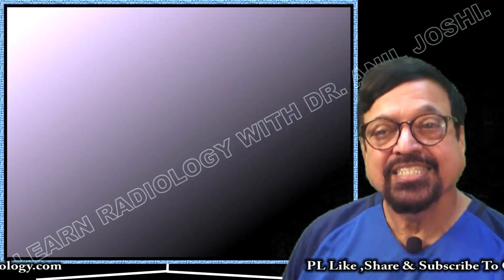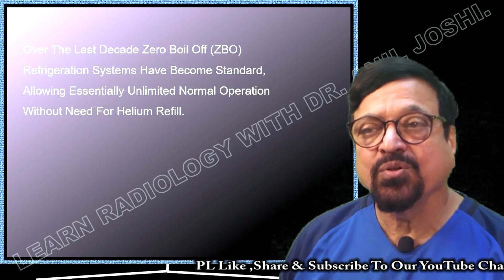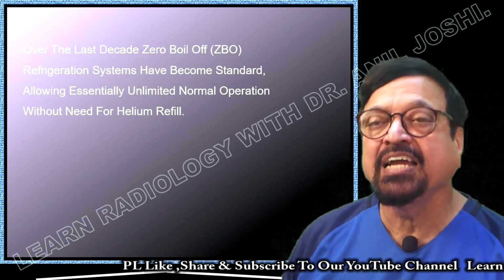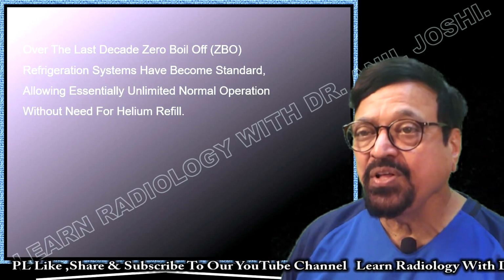However, what we are still thinking now is whether we can develop a machine with zero boil off, that is, a machine which will not require filling of helium over the years. This is achieved nowadays.